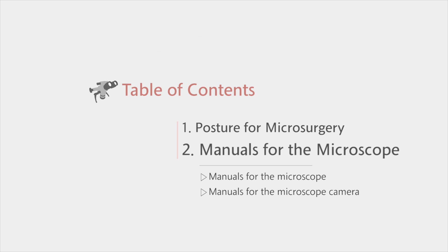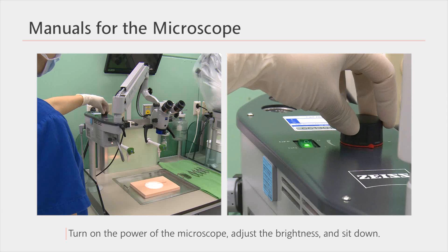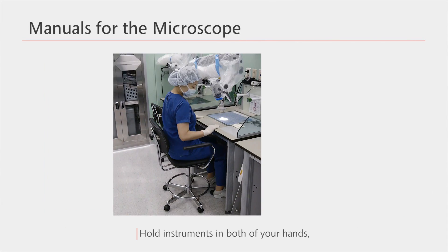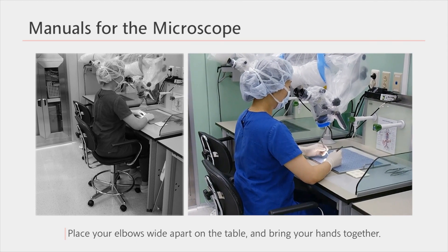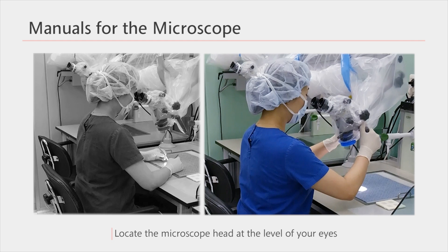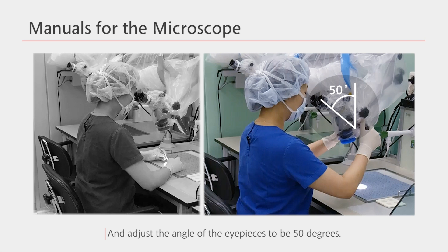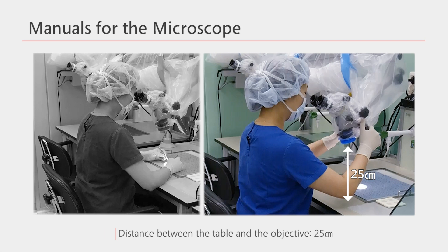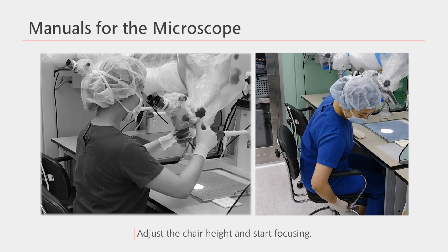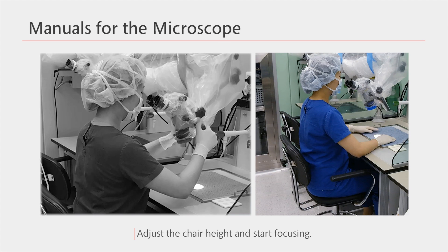Secondly, let's learn about how to use the microscope. First, turn on the power of the microscope, adjust the brightness, and sit down. Hold instruments in both of your hands, place your elbows on the table wide apart, and bring your hands together. The location of your eyes while holding this posture will be the best working spot for the microscope head. Adjust the microscope head and adjust the angle of the eyepiece to be approximately 50 degrees. Adjust so that the distance between the table and the objective is approximately 25 centimeters. Adjust the height of the chair so that your eyes are at the level of the eyepiece, and then adjust the focus eye by eye.